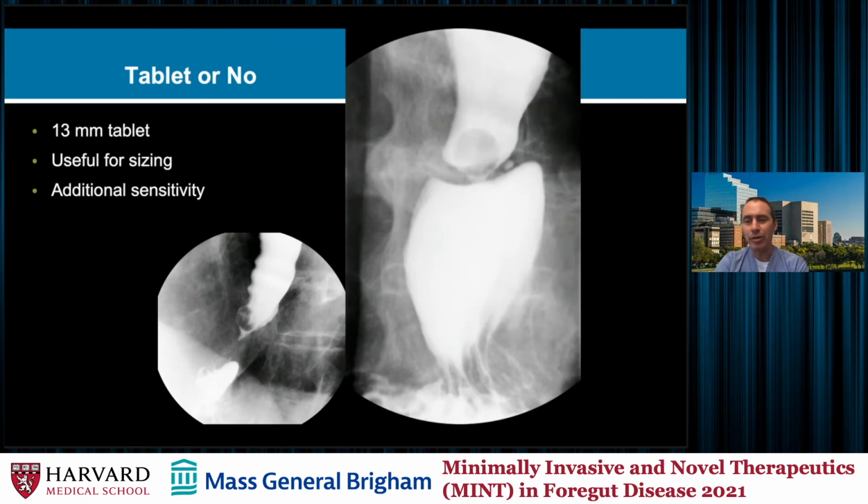And there have been good examples of cases where it looks normal, you give a tablet, it gets stuck somewhere, and there was disease. So in general, it really does add additional sensitivity. It's not uber critical, but it is a nice thing to do.